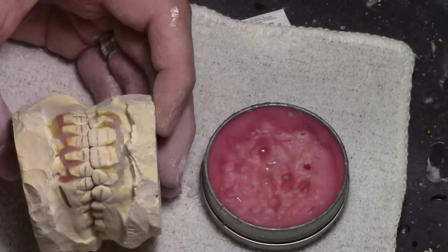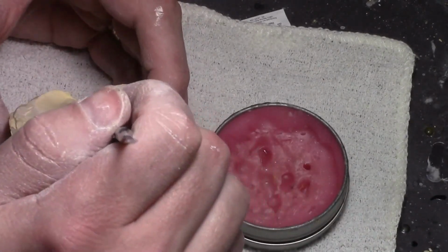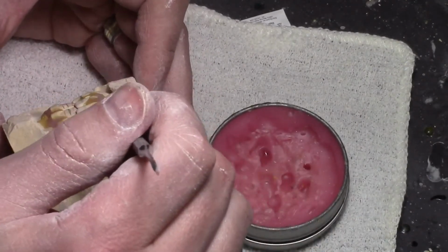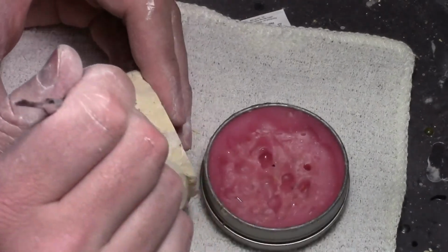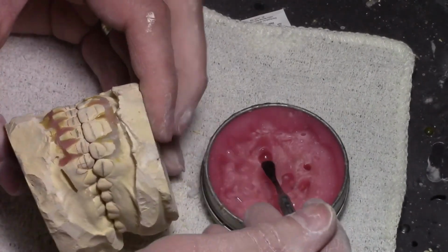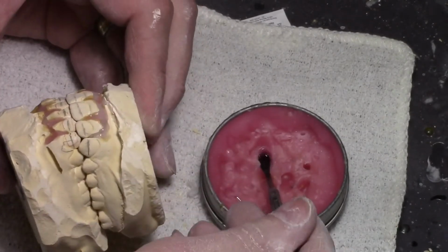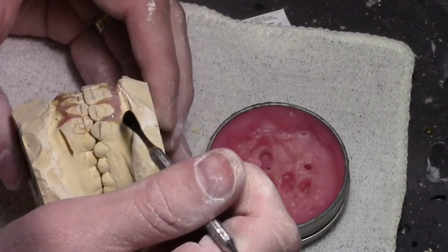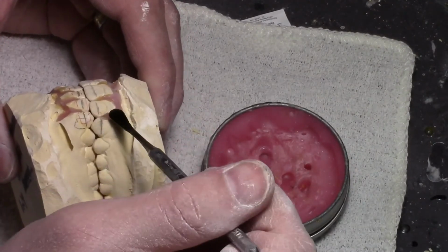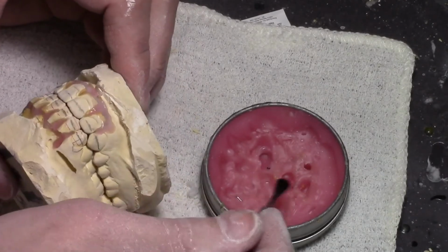And if you hate the teeth coming out after you've built the retainer, sprinkled it, comes out of the pressure pot, and then you go to separate it off the model, and then the teeth all fall out. I hate that. It's a pet peeve of mine. But, you know, what are you going to do? To solve that, you can use a little super glue relative called Z-Base.